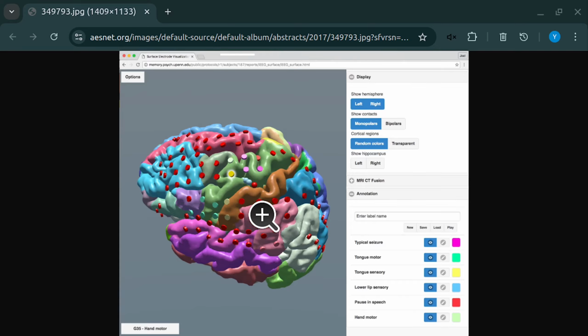I think the circles are depth electrodes, and the discs are surface electrodes. Surface of the brain electrodes, not surface of the head. So those will be ECoG of some sort of arrangement. Supposedly it's a real patient montage electrode placement.